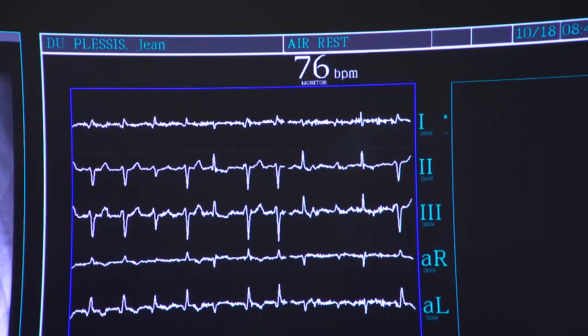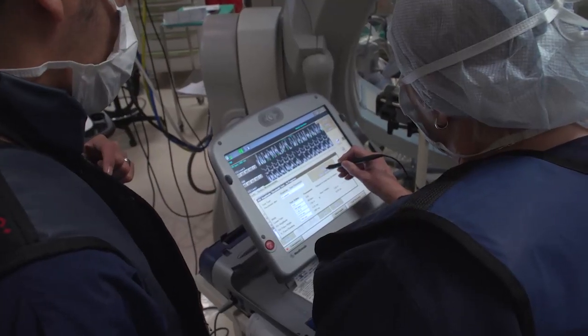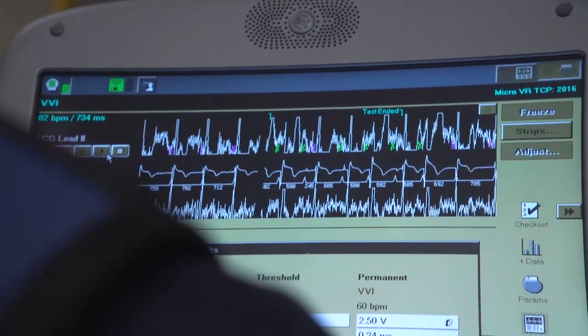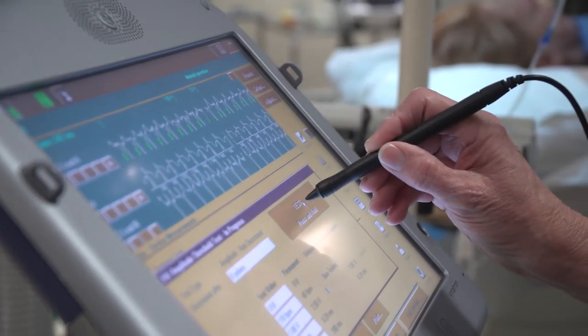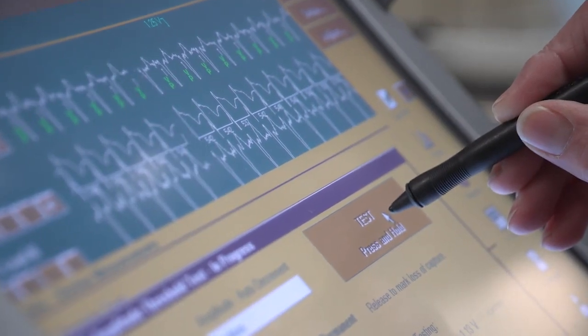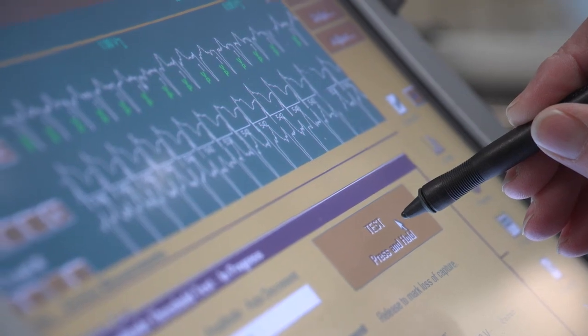And we've got capture at 100, nice and still. All right, it's under one. Fluoroscopically, we've got a very good position. One. So we're aiming for an initial threshold below one.